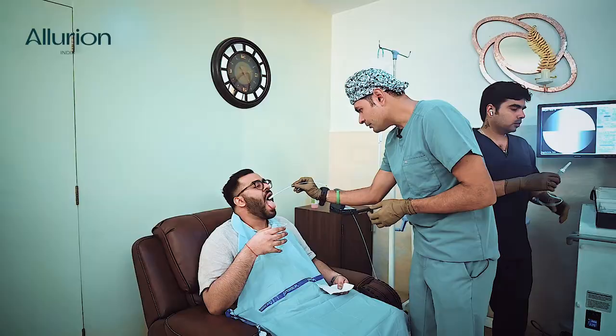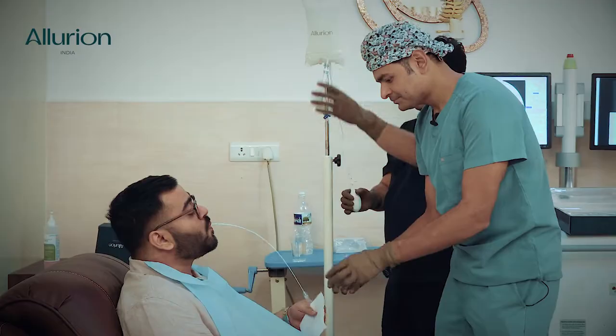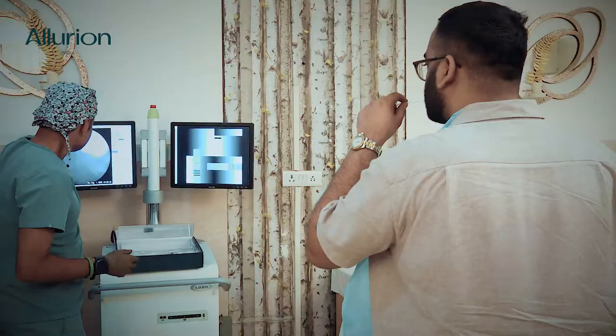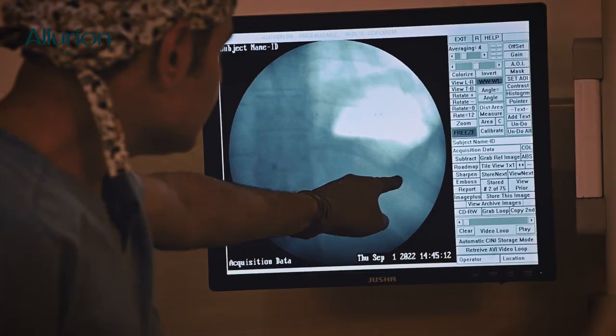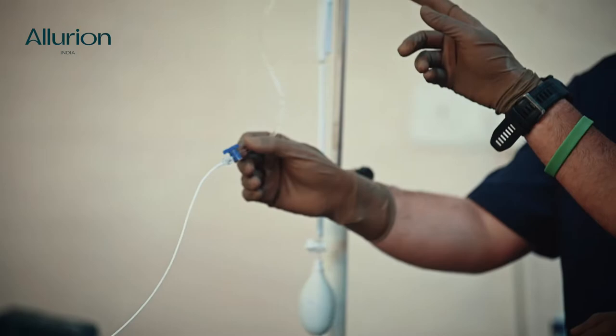Open your mouth, put your tongue out. Start drinking — relax, relax, drink completely, take all the water in. Very good, it's gone. Now I'll remove the stilet and we'll take an x-ray. This catheter has come into your stomach — we know by the tip of this catheter that the balloon is inside your stomach. Now you can come and we'll initiate the filling.